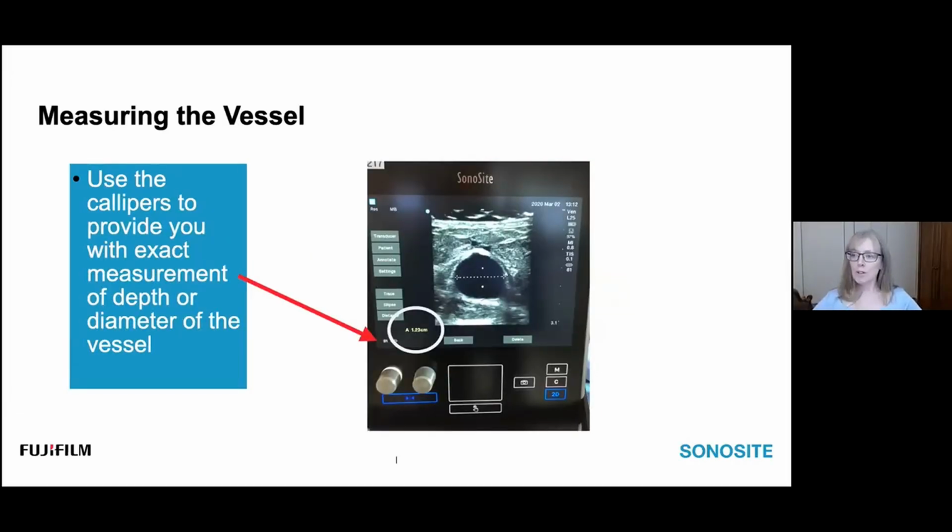So if you're using the ultrasound, you have the luxury of assessing an access before it even needs to be cannulated. Let's say you have somebody presenting for dialysis with a dual access, they have a central line in, and they have an access that's waiting to be ready for cannulation. You should take advantage of that and take the time to assess that access. So you're using the ultrasound not for cannulation, but just to look at the vessel. You'd be surprised at how engaged the patient becomes in what you're looking at. And if you have the capacity to briefly explain what you're looking at, then they become even more interested.